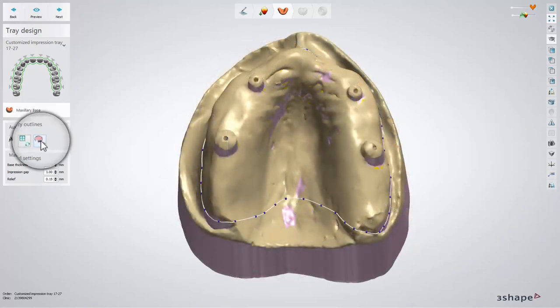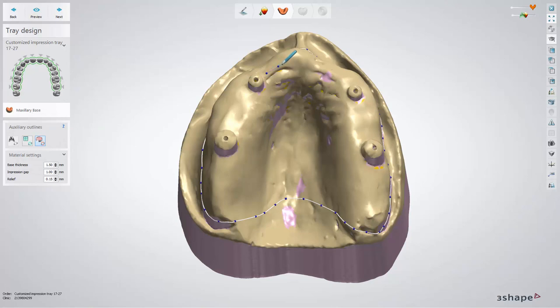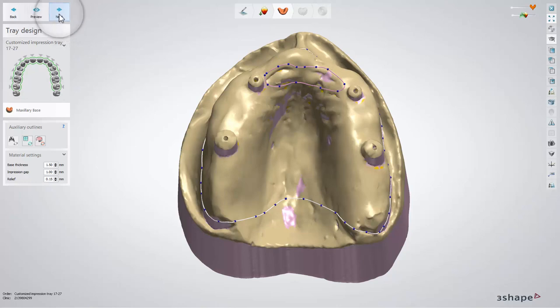Here you can also add a relief zone for any places which can be harmful for a patient. Click Next to move to the finalized step.